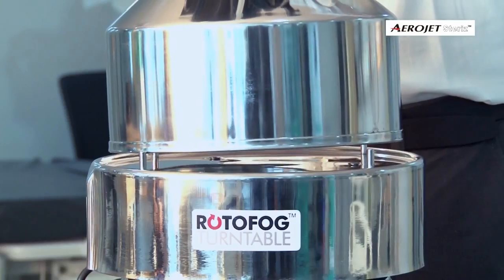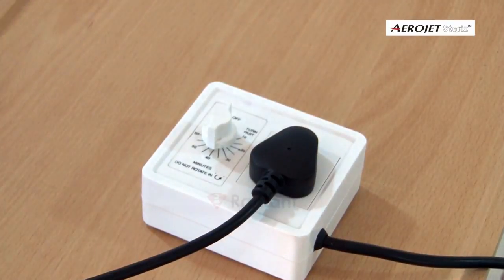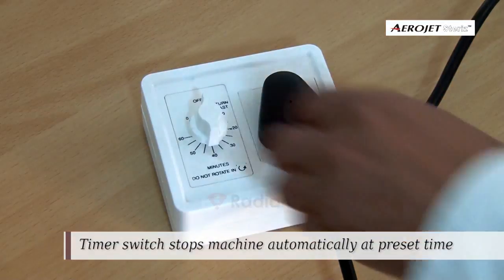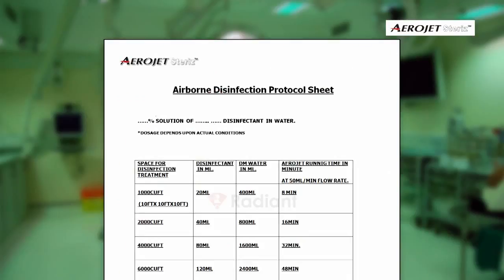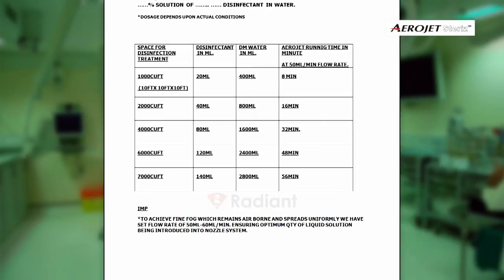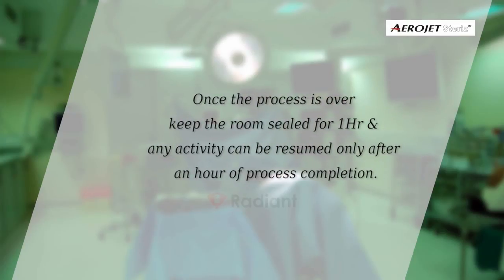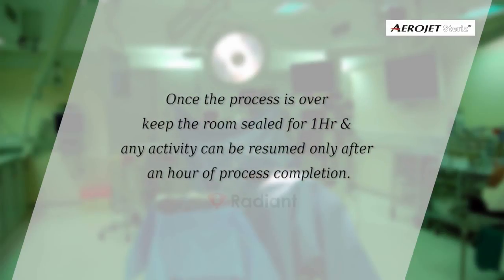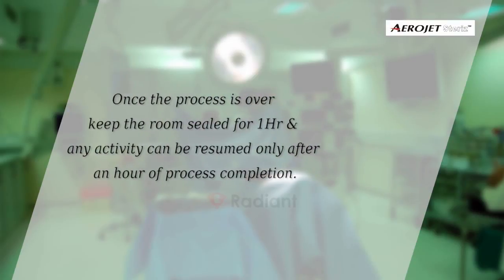Place Aerojet on it and make the necessary power connections. Set the time knob in a clockwise direction to a time value determined from the protocol sheet. Once the process is over, keep the room sealed for one hour, and any activity can be resumed only after one hour of process completion.